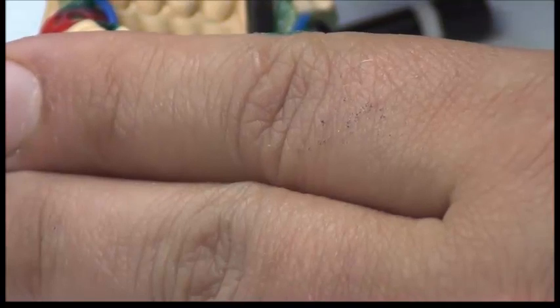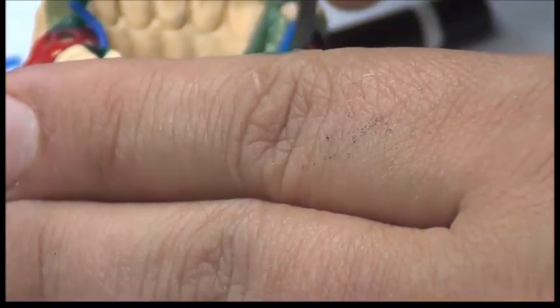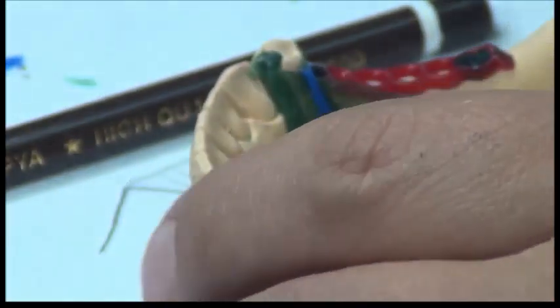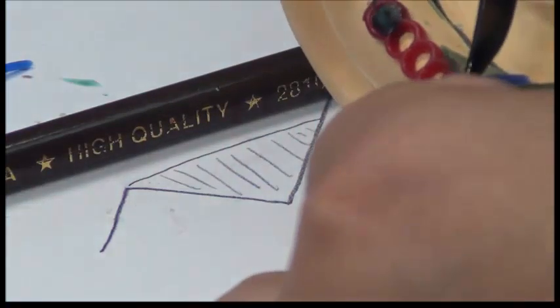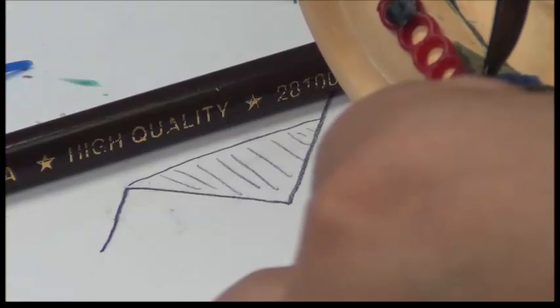So you can see that the external finish line runs in a line parallel to the internal finish line, but more anterior to it. Okay? And then what I'm going to do, I'm going to add wax from this side to join the two together. So a drop of external wax, it's not the same wax, is added to join them together.